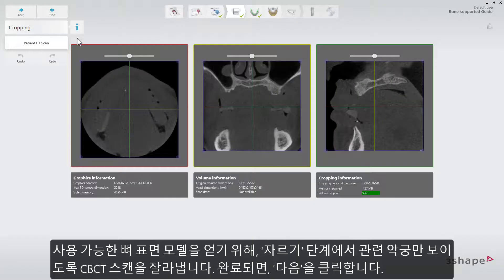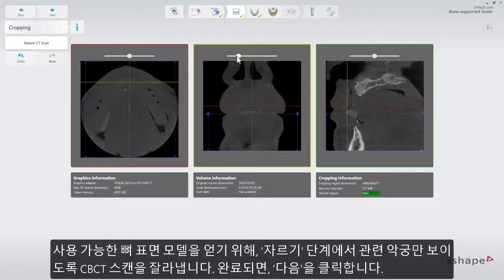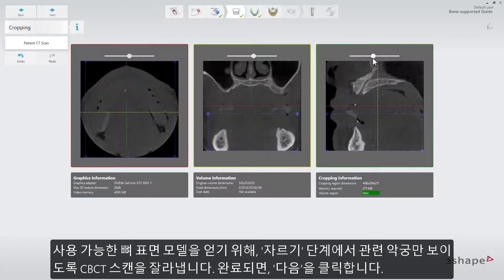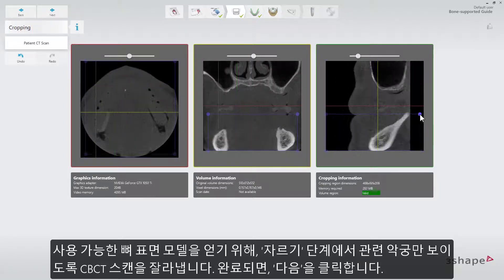In the Cropping step, to be able to get a usable bone surface model, crop the CBCT scan only to show the relevant jaw. When done, click Next.